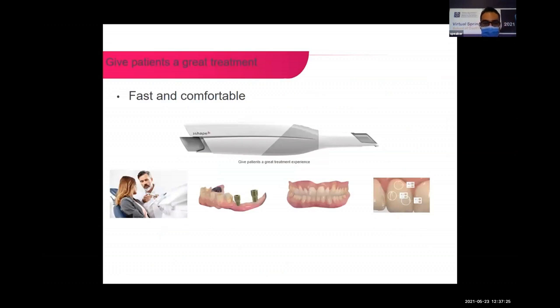Here are the intraoral scanners that most of us use or know about. You can see we have a surface scan of the oral cavity. In this superficial scan, we have both soft tissue and hard tissue. The hard tissue is the teeth.